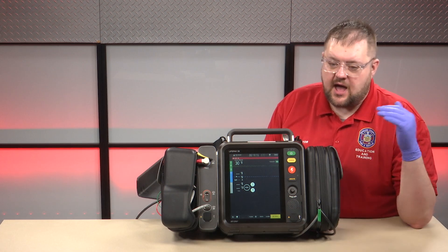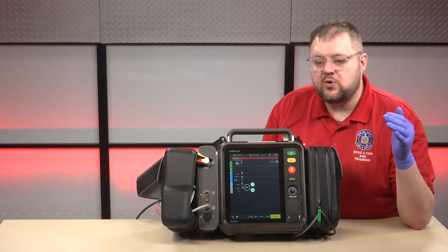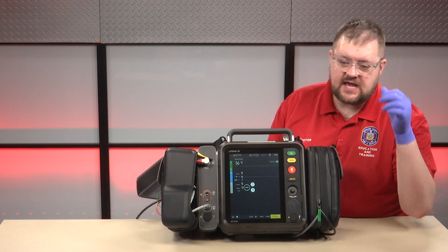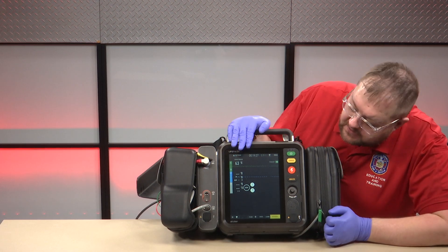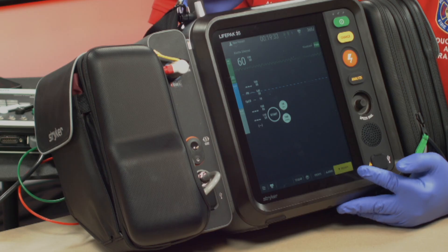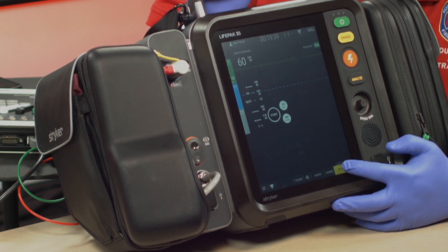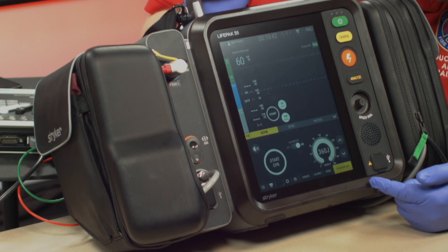First, we'll follow our cardiac arrest procedures, and then very quickly we'll get the pads on the patient. In this case, we'll say the pads have been placed. We're on the home screen, and down here at the bottom you'll see this bright yellow button that says Manual Defib. We're going to press that because we do not want to go into AED mode since we have an ALS clinician on scene. When I press that, my defib menu comes up.